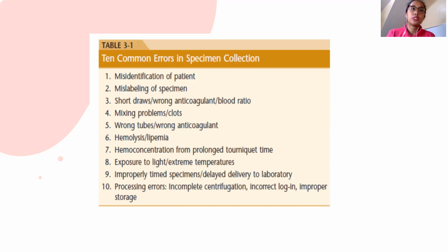So, hemolysis or lipemia, my teacher said hemolysis is a cardinal sin. You have to repeat your phlebotomy if there is hemolysis. Ulitin mo. Lipemia, so if there's excess fat. When there's lipemia, we don't repeat it, but depending on the test. Number 7, hemoconcentration from prolonged tourniquet application. So, the tourniquet application should only be done less than 1 minute. So, or else, magkakaroon ng hemoconcentration.